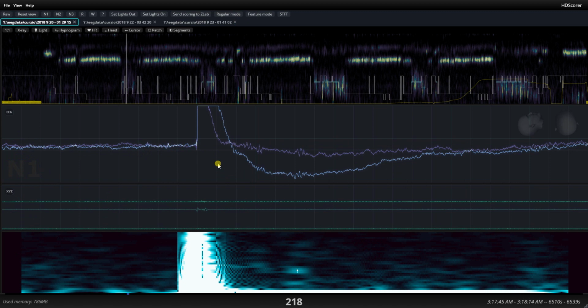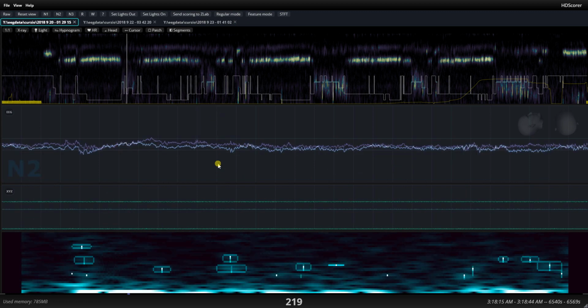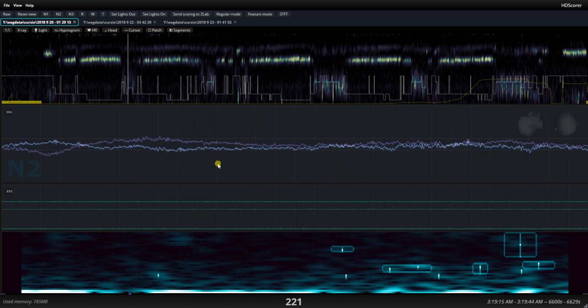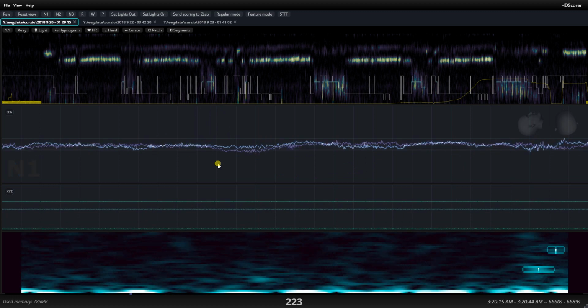Then we've got N1, makes sense. We don't have any significant features to base anything on right there. And then we have some spindles here. Then we have K complexes, so it's N2. Then it goes back to N1.